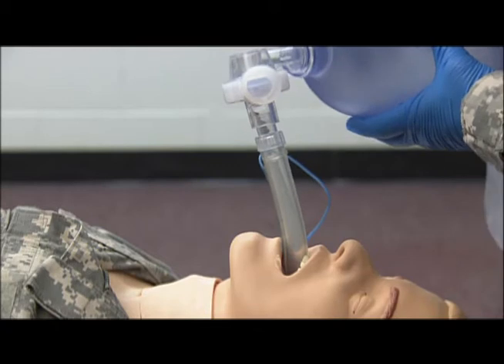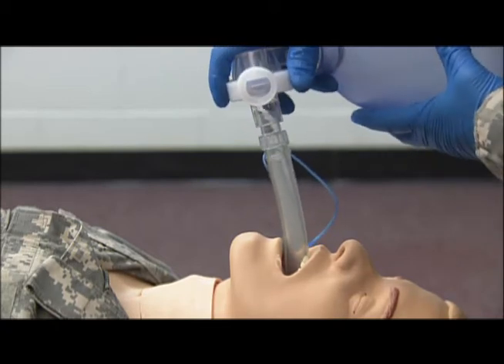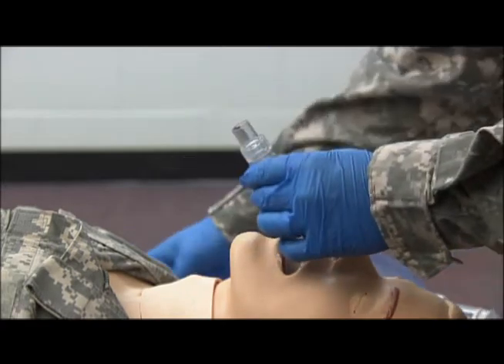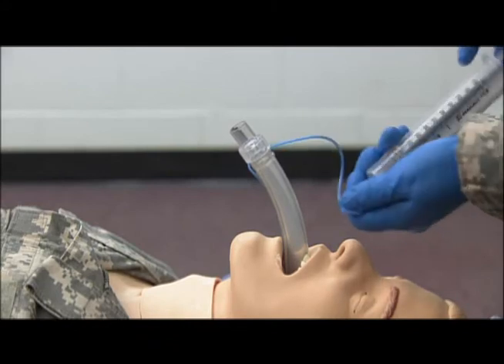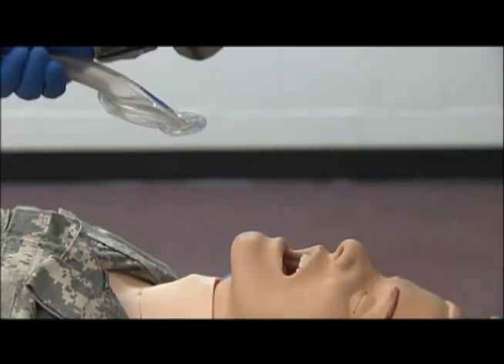We will mechanically breathe for our patient one breath every five seconds. If the patient becomes conscious, we want to immediately deflate the balloon and remove the LMA.